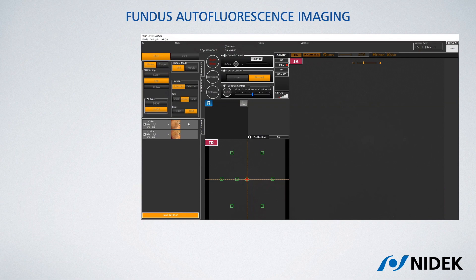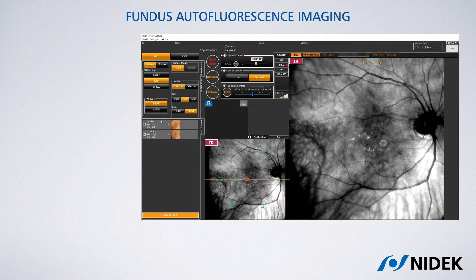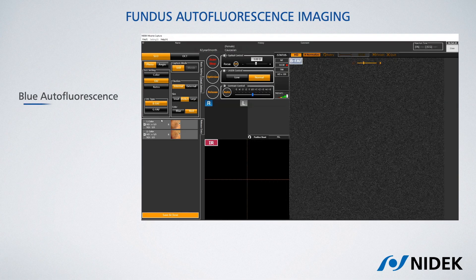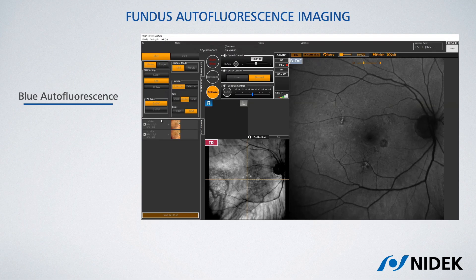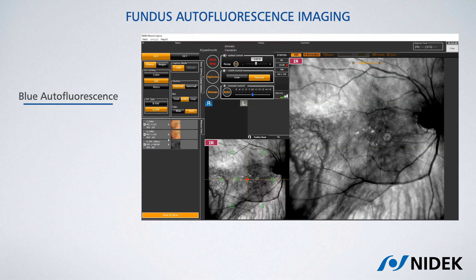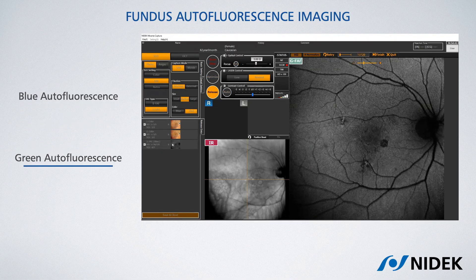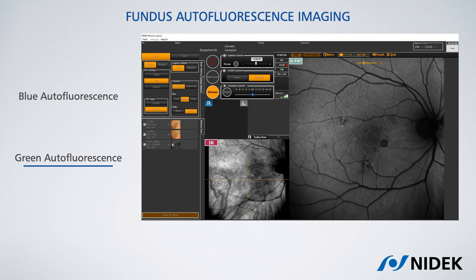The same procedure applies when you want to capture fundus autofluorescence images, with either blue light, which is the most common form of autofluorescence, or with green light to minimize the absorption effect due to macular pigment in the foveal area.